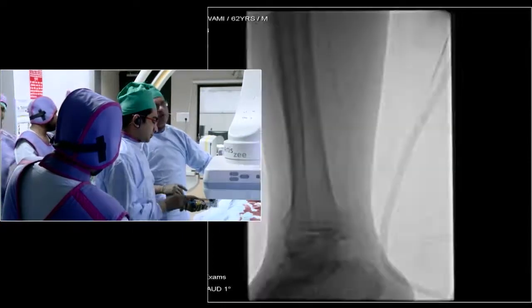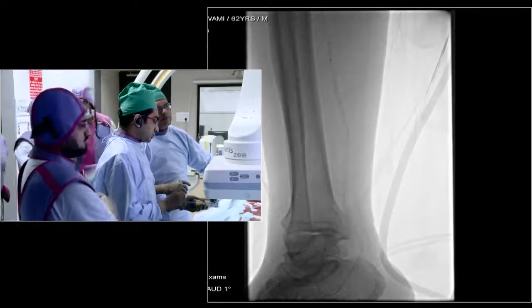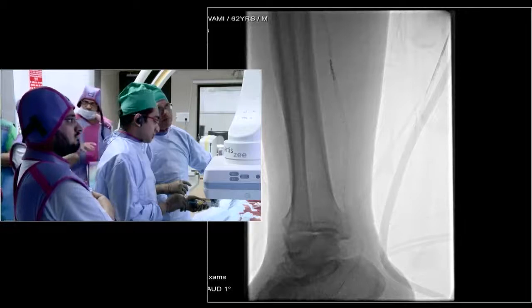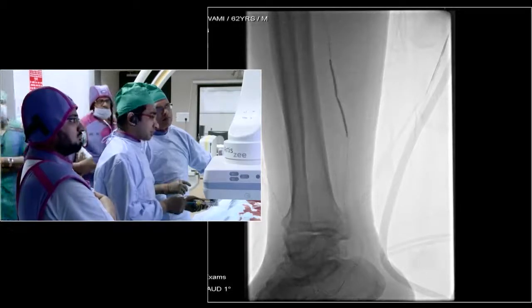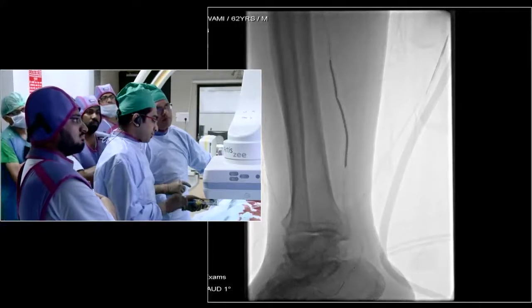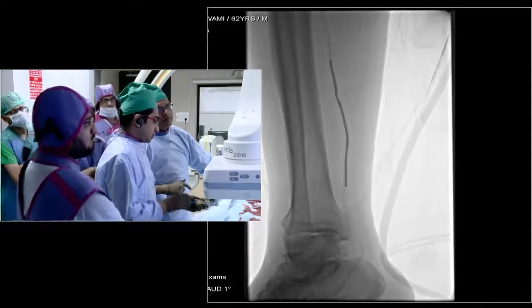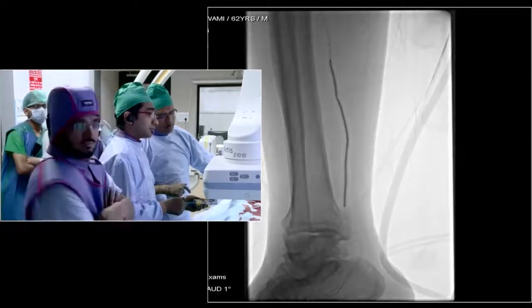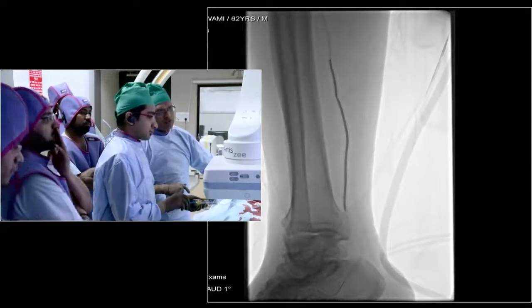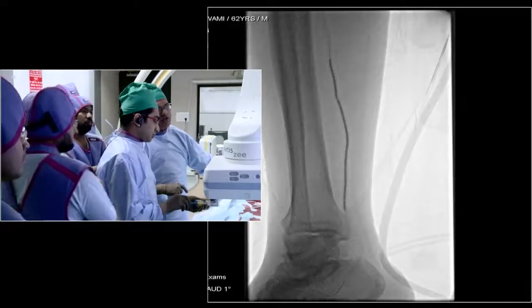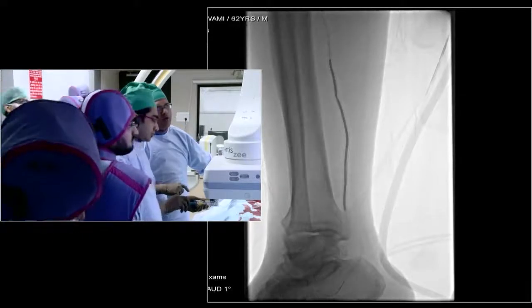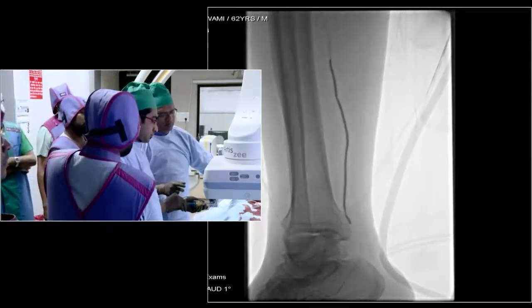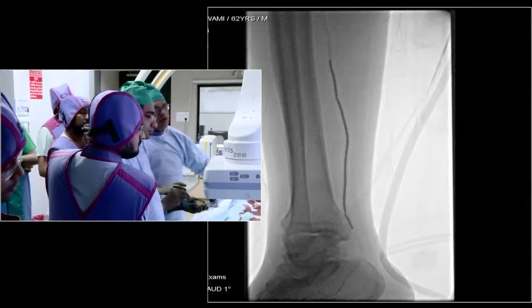We are inflating the balloon now. I'm at 2, 3, 3... We can see that narrowed segment. The plan is to go up to 6 atmospheres only, which is nominal. We are at 4 atmospheres right now and I am planning to go maximum to 6.